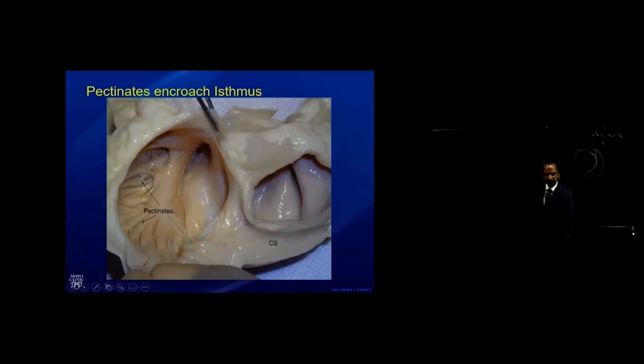So if you do a cross section here at the ridge, you have fibers on the appendage side, fibers on the vein side, longitudinal fibers of the ridge itself, and then deep to this would be fibers left behind by the left SVC. So if we want to ablate that epicardial tissue, either because there's a trigger there, or we need isolation of the vein, or we have flutter that could go through there, then that becomes a vantage point for us to use.